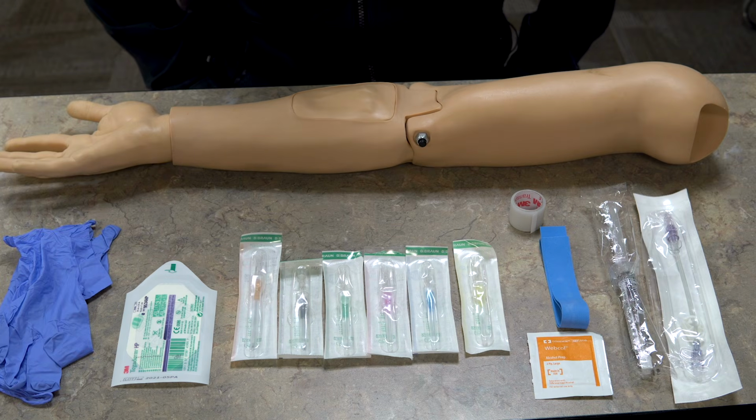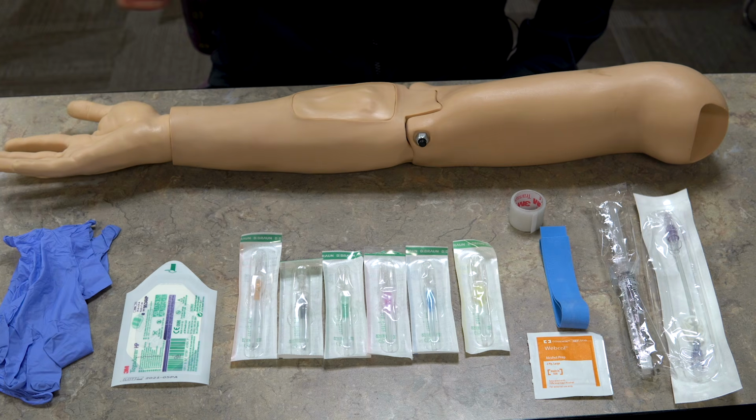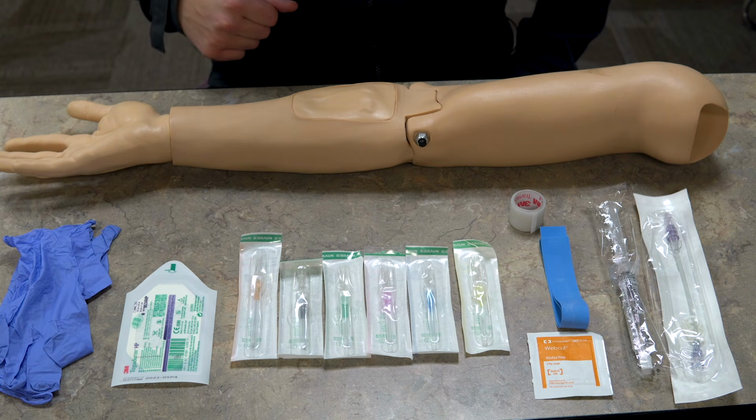All right, now that we got that stuff out of the way, let's go down to the bench and I'll show you how to set up your IV, how to select your equipment, and ultimately how to start one in the field. All right, so laid out in front of me, I have everything that you need to start an IV. We're going to start talking about the catheters, and then we'll move on to everything else and actually show you guys how to start one.